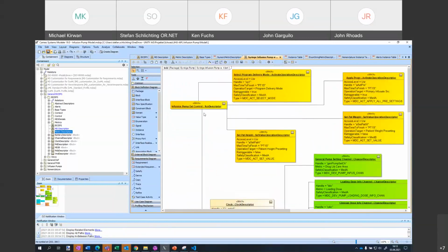And what we also created is, just as an example or reference, some very simple operations to change, for example, the patient weight that is used as a parameter for calculating or checking drugs, as well as the height. And we also included an activate operation description, for example, to select the program delivery mode as one example, or to apply all the presettings that we might have in there. But that's more exemplary. That's not the full model.